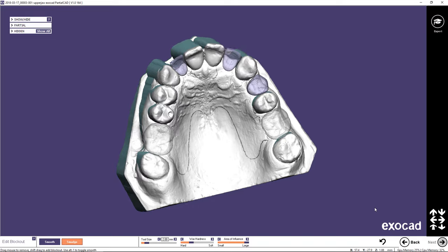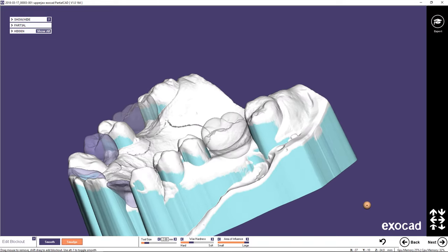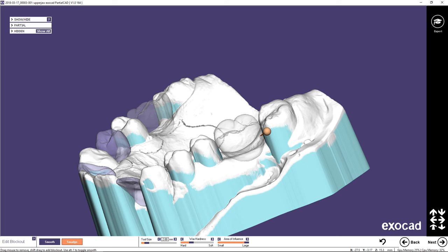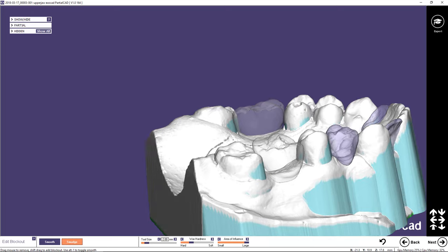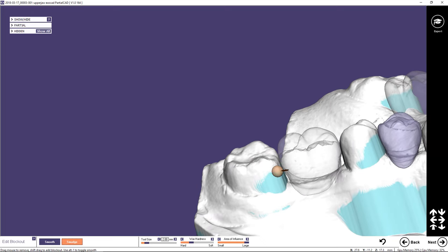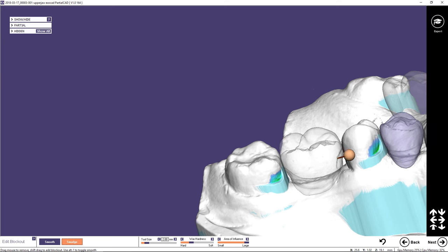Begin the Edit Blockout step by removing wax where the clasp tips will be placed — click and hold the left mouse button while moving the tool over the blockout wax. In this example, Ring Clasp will be placed on the molars and Acres Clasp on the pre-molars. The tool size can be adjusted by holding down the hotkey Shift and scrolling the mouse wheel. To undo a previous action, use the hotkey Ctrl+Z.